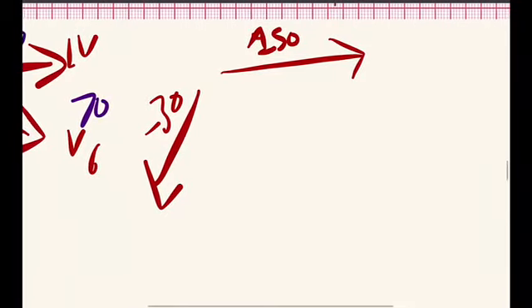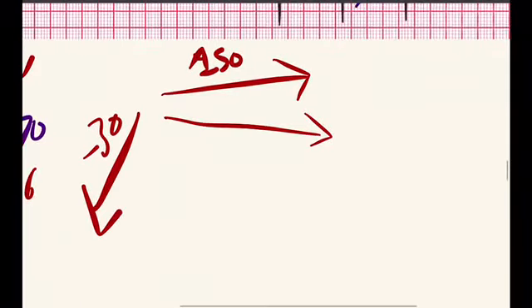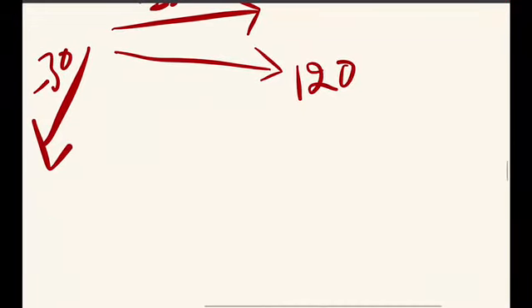Now the resultant vector will be more towards the left ventricle, and the magnitude will be 120. So this will cause more of the left axis deviation. The resultant vector goes more towards the left side. This is a very simple concept, guys.